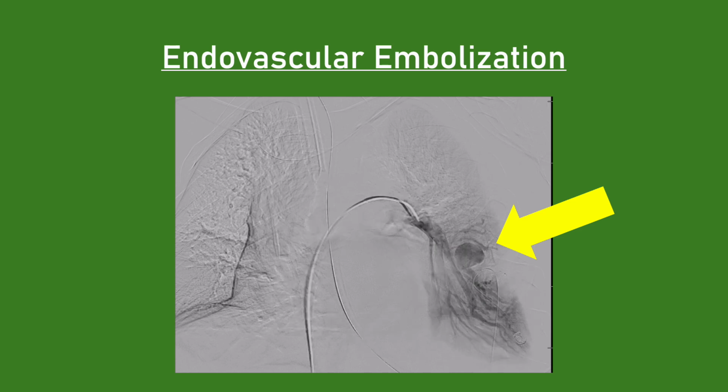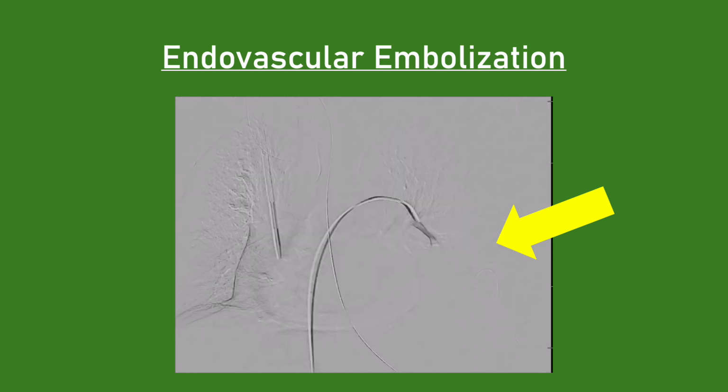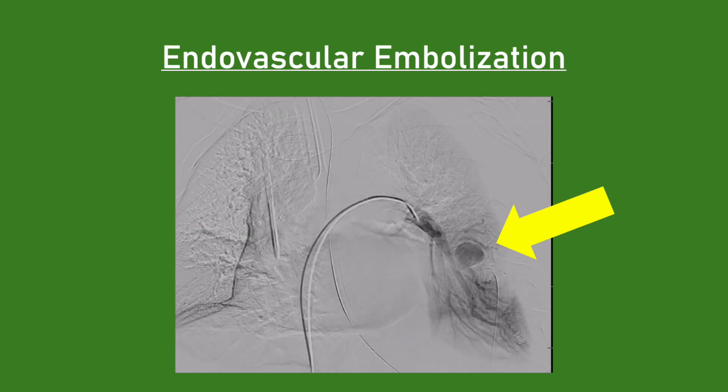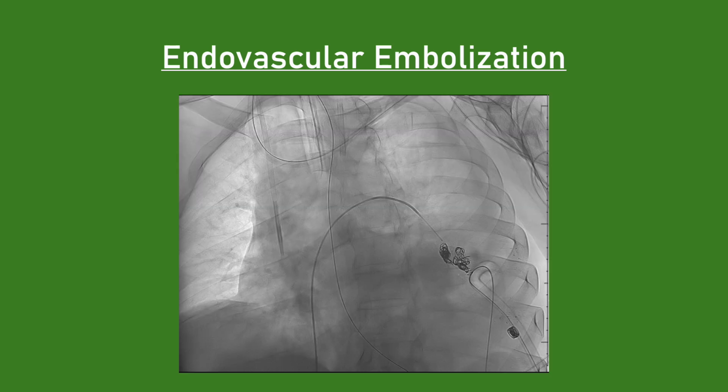And now to discuss our actual angiography case. As you can see here in this video, we have a 5 French diagnostic catheter parked in the left pulmonary artery. After contrast administration, you can see swirling inside of a large pseudoaneurysm in the left mid-lung, which we then chose to proceed with coil embolization, as seen on the next slide.